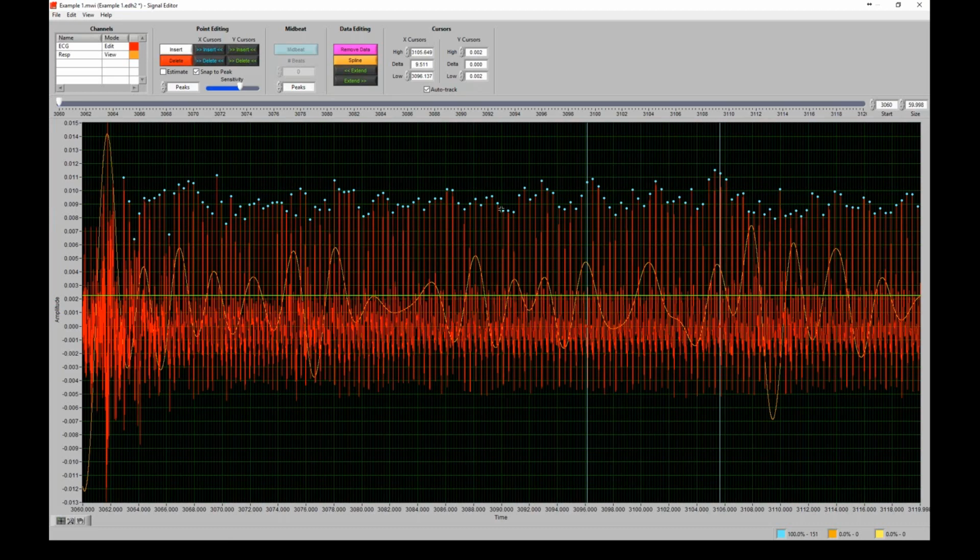So we can remove data from the beginning and we can remove data from the end, but we can never remove data from the middle. And the reason for that is, again, back to that rule, we need 30 seconds of contiguous data, not 30 seconds of data overall. By deleting data in the middle, we're basically creating an incredibly long interbeat interval between these two peaks. That's going to be interpreted as an increase or decrease, depending on exactly what happened, in variability for the segment, and it's going to skew our results. So we would never want to do anything like this.